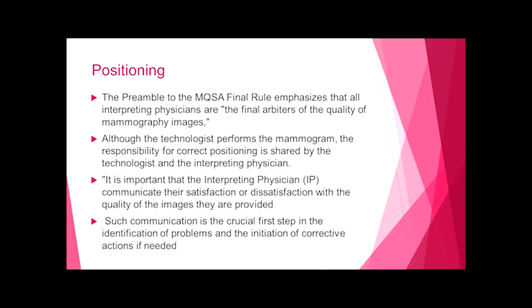But it is a shared responsibility between the interpreting physician and the technologist to determine what is acceptable and what isn't. Once you get started on that, and the interpreting physician applies the criteria to their images, and the technologist knows that those are going to be applied, and the differences can be discussed and worked out, then both sides will be able to see, hey, I don't think that's going to be acceptable.